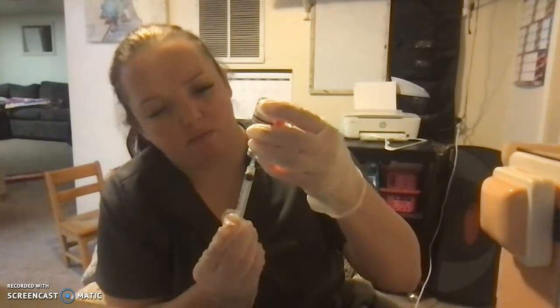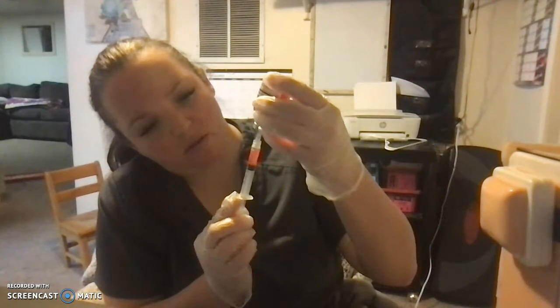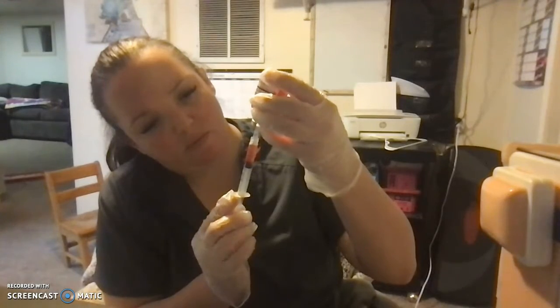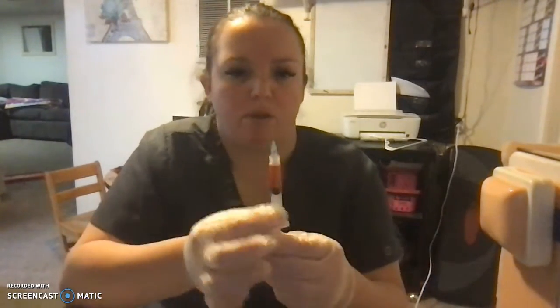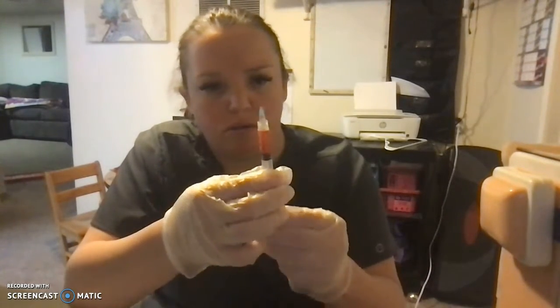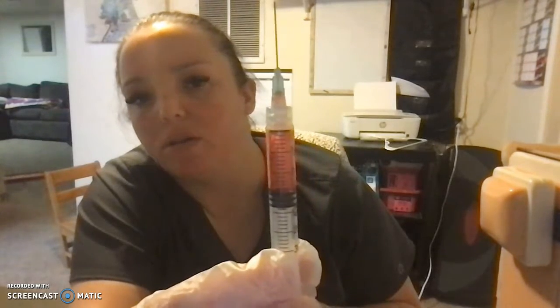Pull back 1.5 mLs. Ensure that there's no air bubbles. And there is 1.5 mLs, which equals 6 milligrams of morphine.